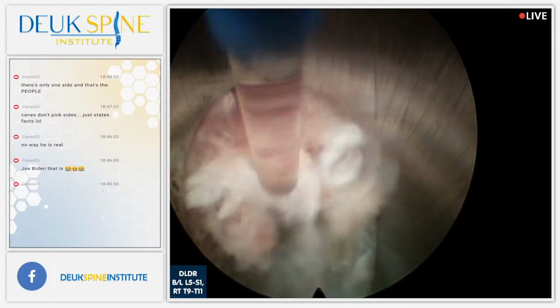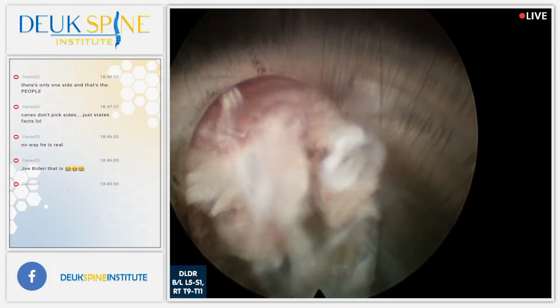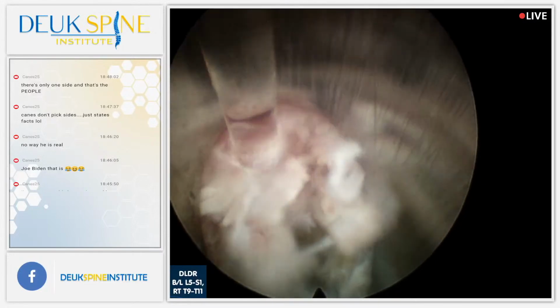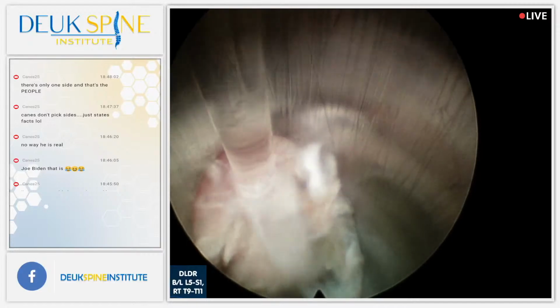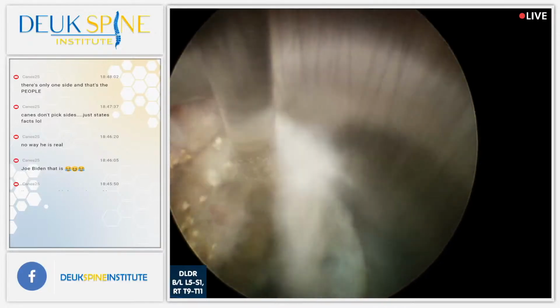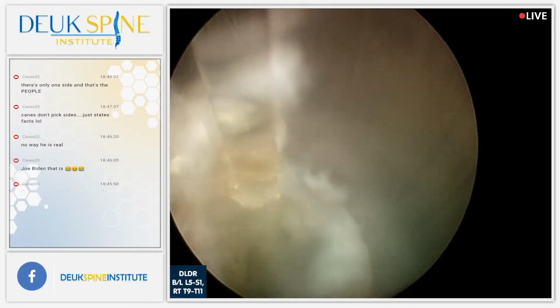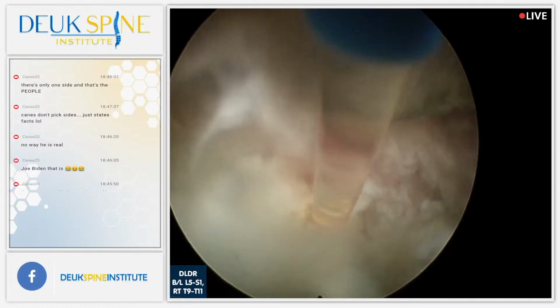That is inflammation right there. Remember we talked about the inflammation? Henry, that's a really good inflammation shot right there. See the laser? That's 1 millimeter wide. And now I'm blasting away all the inflammation. By doing this, the pain goes away. Back pain, even the leg pain. Look at all that inflammation.